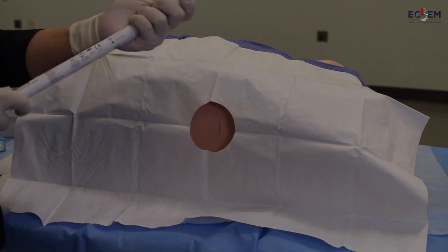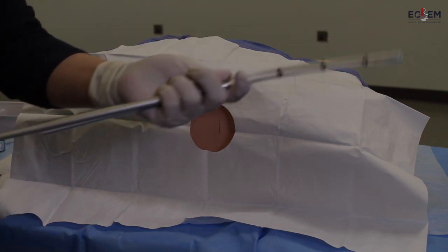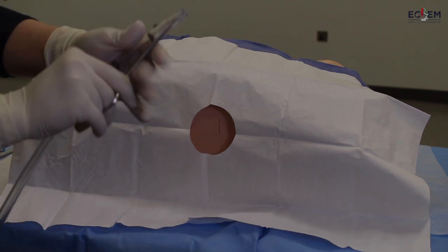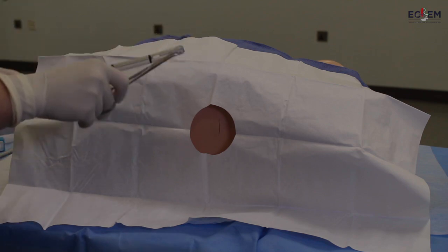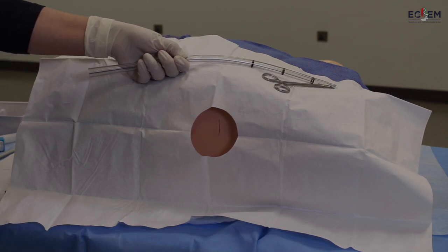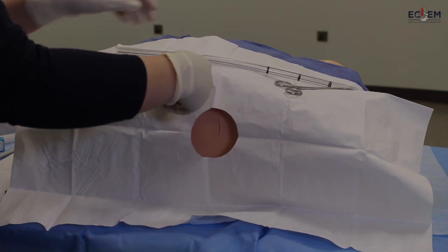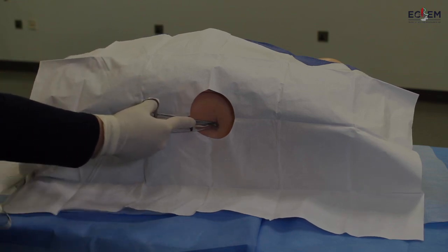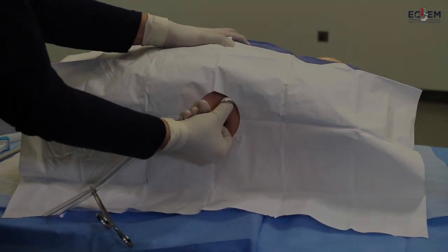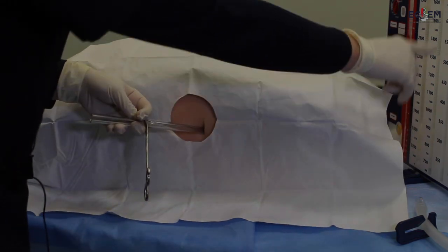A 32 French tube is used, possibly for hemopneumothorax. Previously this was done with a trocar, but now it's safer to use a Kelly clamp. We clamp it here leaving the tip blunt, then measure from the apex to the incision area and place another clamp so that when the tube is inside, fluid does not spill. Insert the tube through the incision and tract, directing it superiorly and posteriorly, then remove the clamp and insert it further.